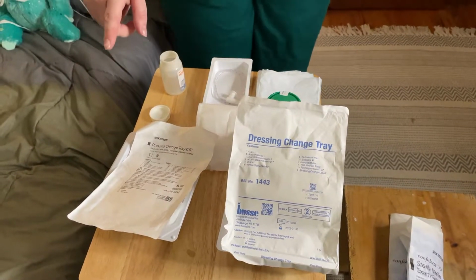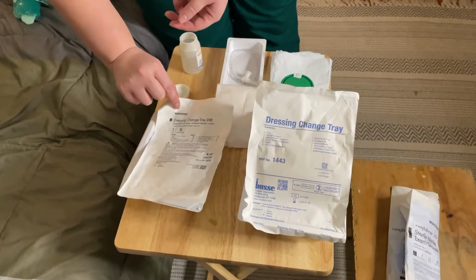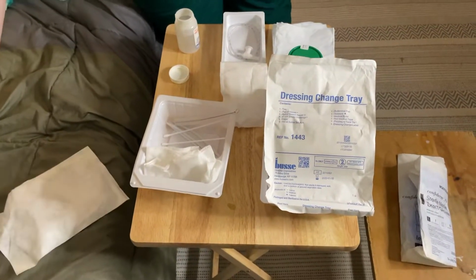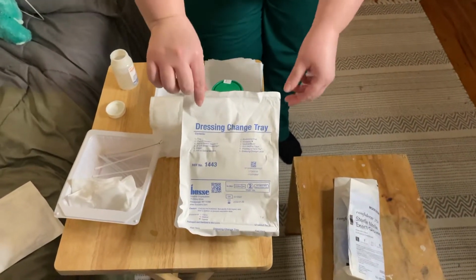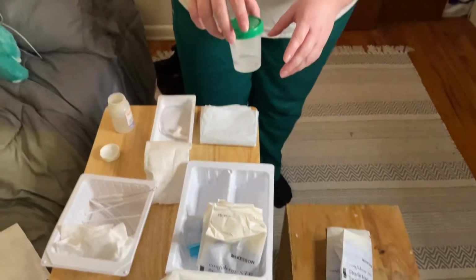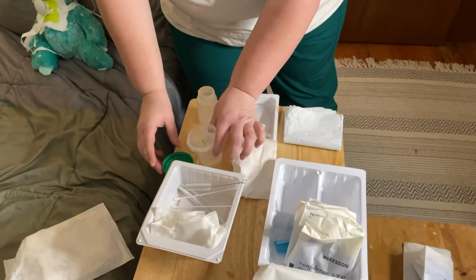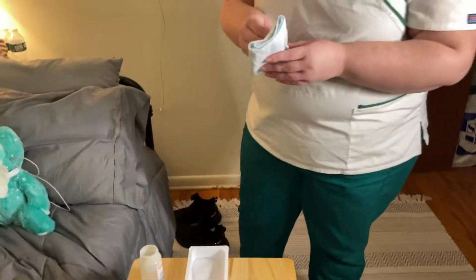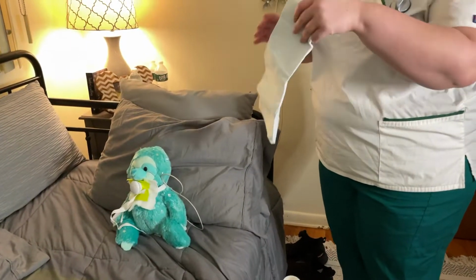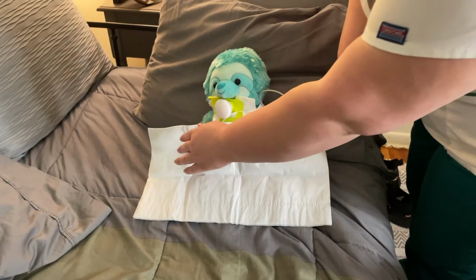I have my trach dressing kit, and I'm going to open that away from myself as well. And I have my inner cannula, which I'm going to open away from myself. I have my sterile gloves down here. This is my other sterile saline for when I'm cleaning the patient. So you want to make sure that everything in the packages remains sterile. I'm going to take my towel and put it on the patient just in case there's any dripping or anything like that to keep the patient dry.